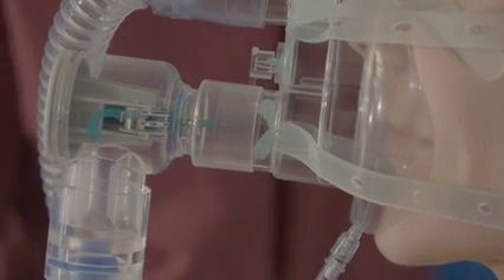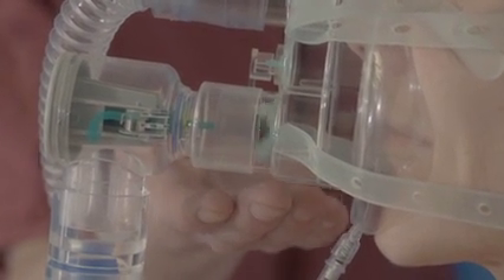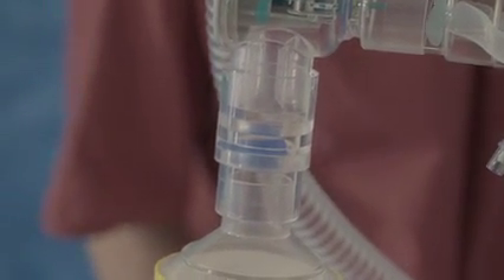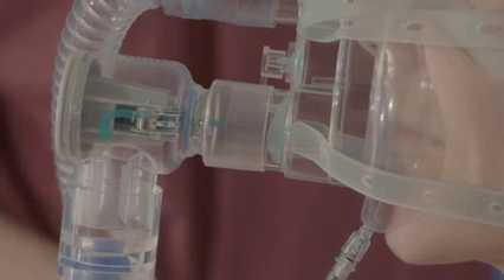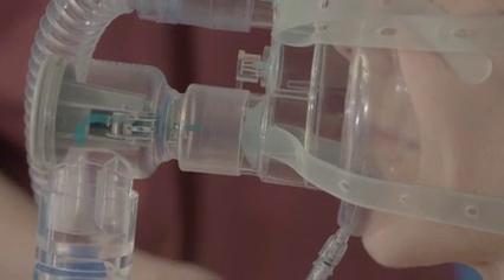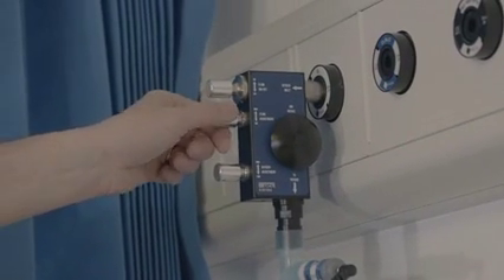If the flow is too high, then we are being incredibly wasteful of oxygen, and it also starts to become uncomfortable for the patient. We start to see the green valve open continuously through the respiratory cycle, fluttering at all parts. The blue valve will be consistently in the down position, and we will feel an increased flow through the respiratory cycle. If we were to take this to the absolute extreme, the pressure in the circuit will start to rise above 10 centimeters of water to the point where our safety valve starts to open — we may hear a noise and would then start to feel a flow of air through the safety valve. If that is the case, adjust your flow downwards by turning the button clockwise until we get all our markers back into position.